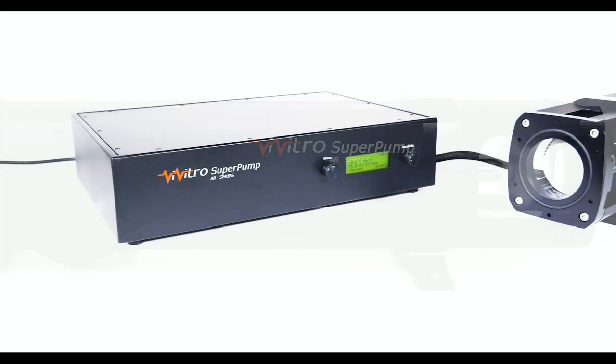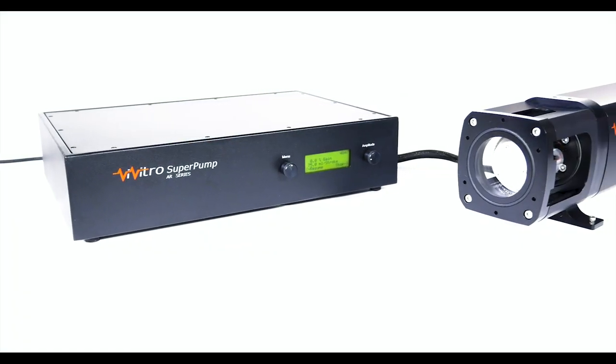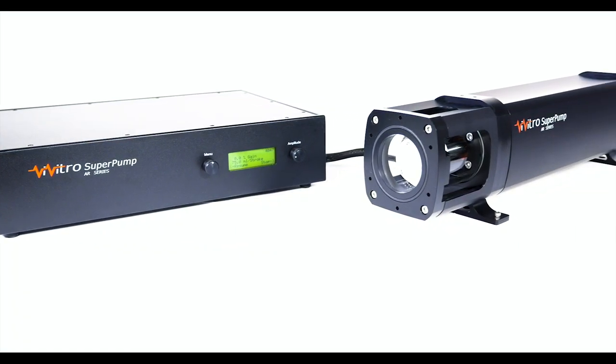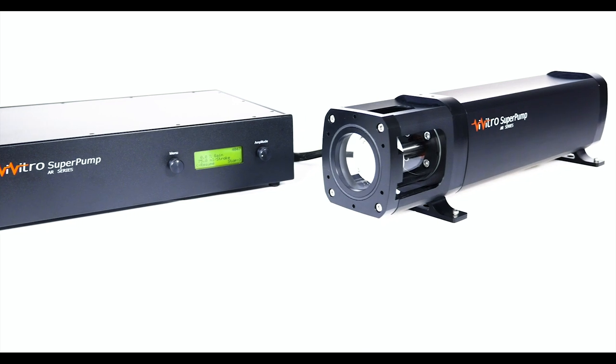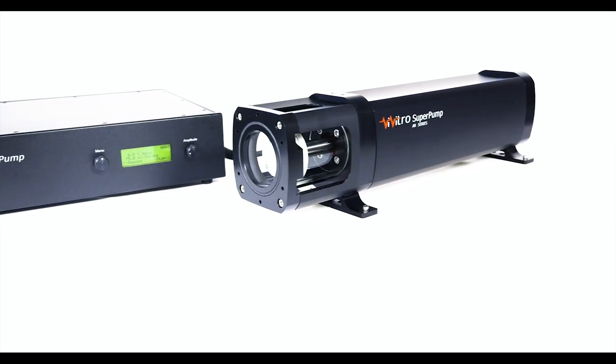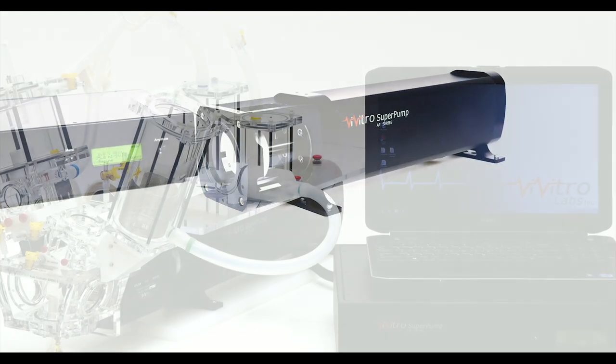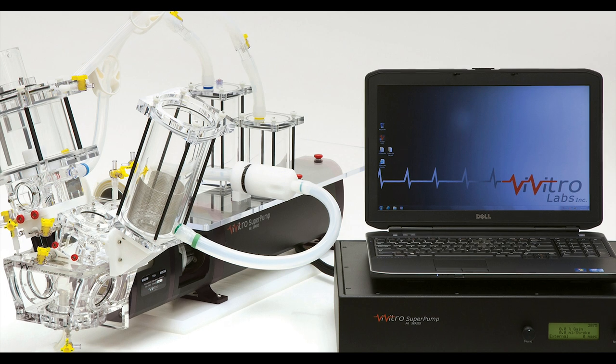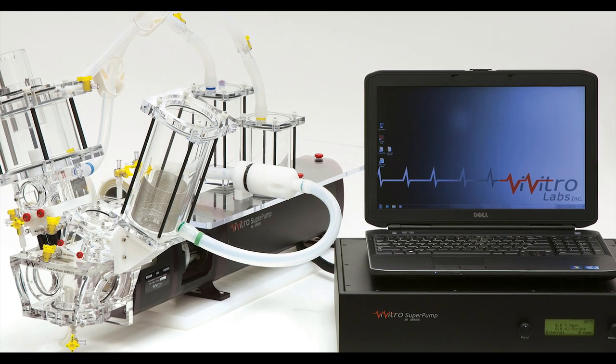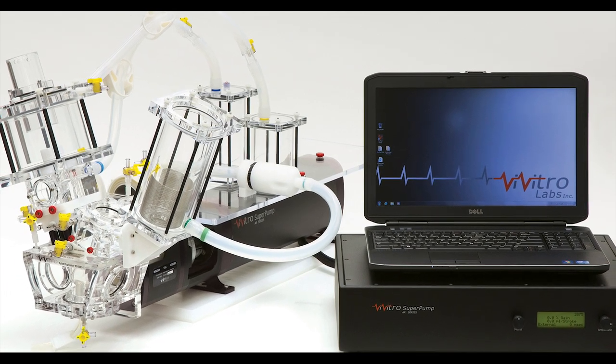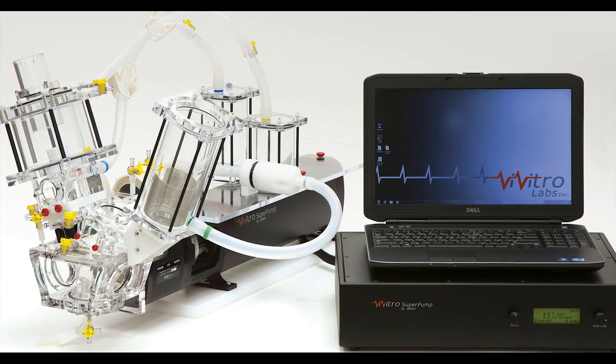The Super Pump is the most widely used and cited pump for creating pulsatile flows. It can be used with Vivitro accessories or independently produced accessories to create reliable flows for any type of cardiovascular device.